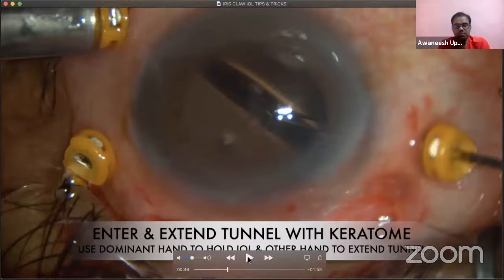Also, when you're going in, pinching the IOL at the surface of the retina, just have a small pinch. Don't open your jaws too much, just like you do when picking up the ILM. You want a very minimal amount, exactly at the optic-haptic junction, and bring it up vertically. Vertical kind of helps you.